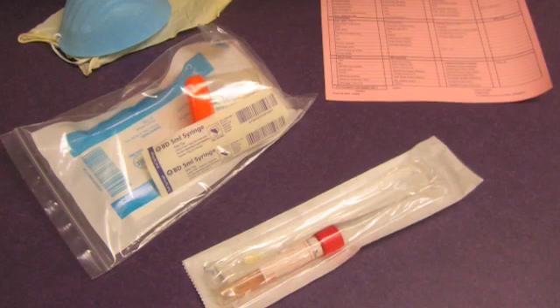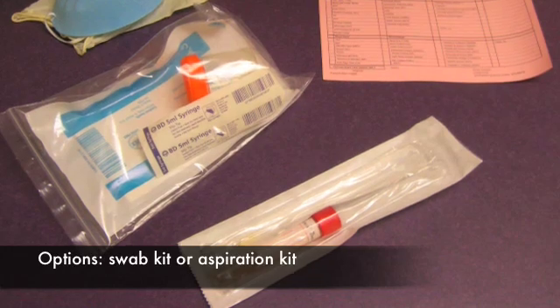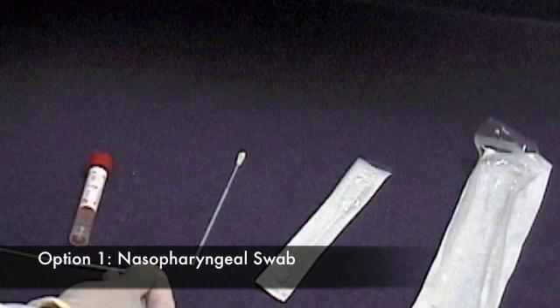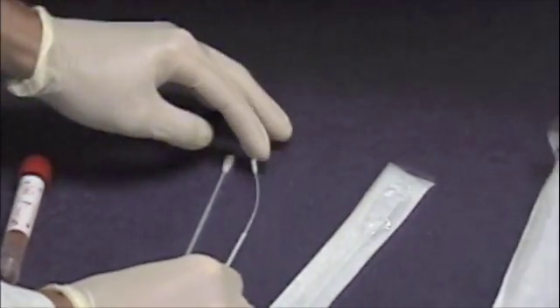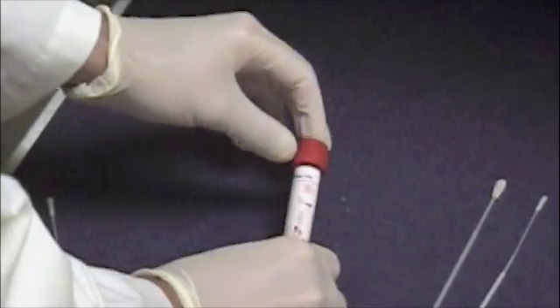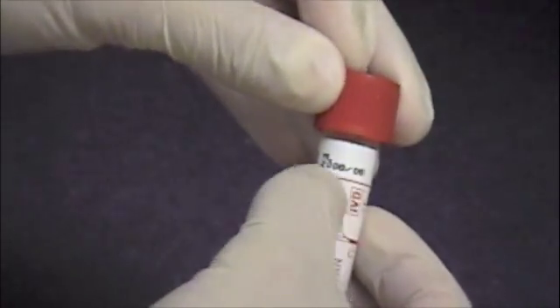You will also need a lab requisition and either a nasopharyngeal swab kit or an aspiration kit. If using the swab kit, use the smaller, more flexible swab for the nasopharynx. Ensure the viral collection medium has not expired, as expired samples cannot be processed.